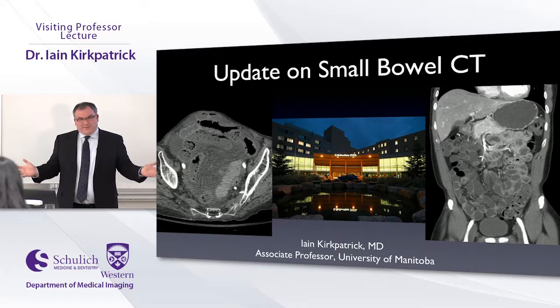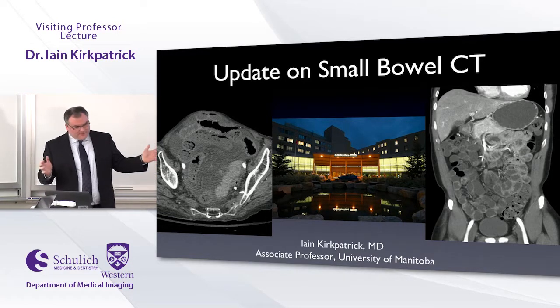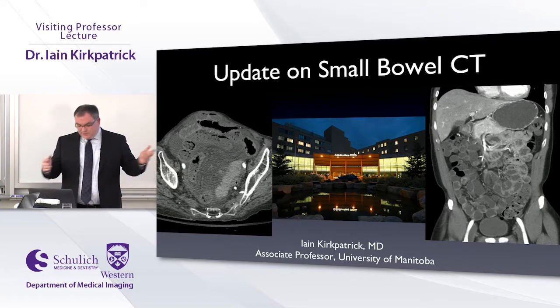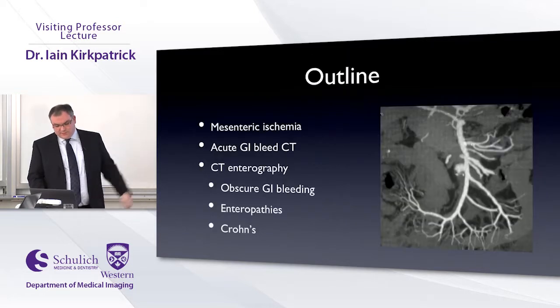Well, thanks everybody for coming, especially those of you that are not abdominal people. I apologize for all the bowel in this talk. So I was just going to talk a little bit about small bowel CT tonight. I have nothing to disclose.